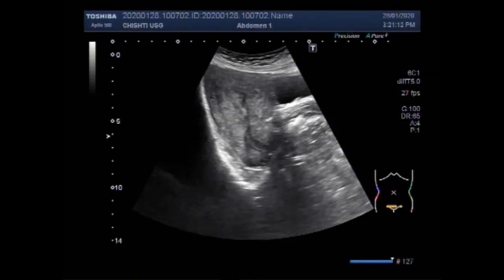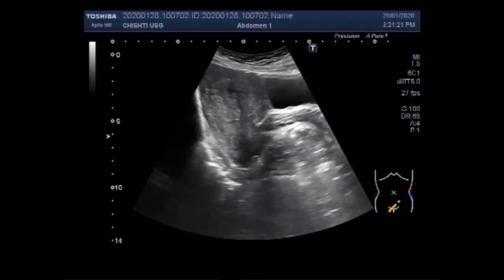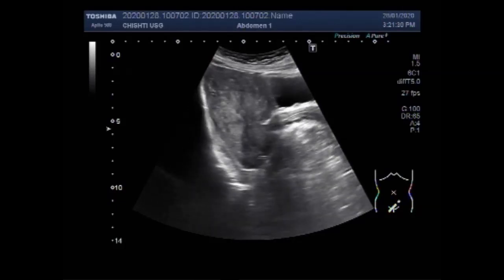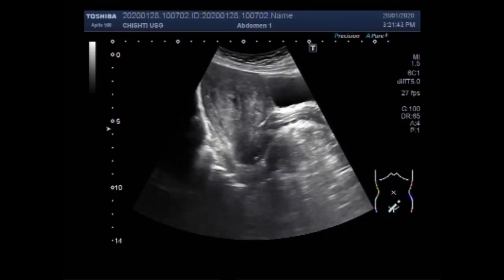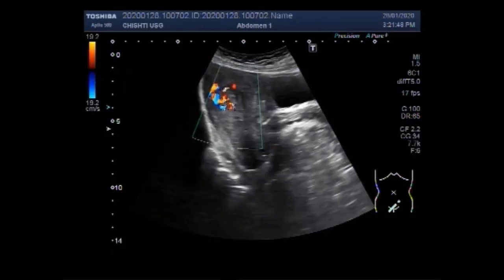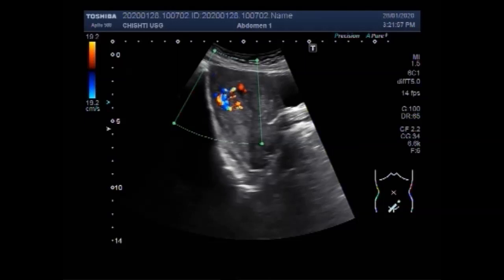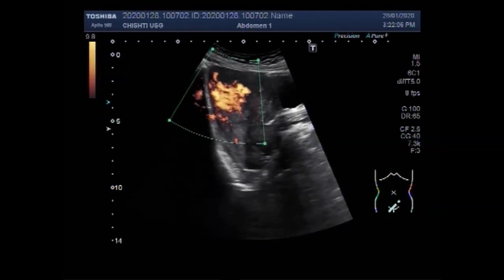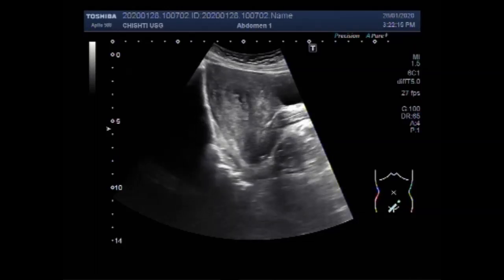This ultrasound video shows multiple cases — about three cases — of fibroid uterus. You can see the uterus, urinary bladder, and cervix. There is a fibroid in the central portion of the uterine cavity. A significant blood flow is seen in the fibroid, and this is a semi-solid to solid mass with a small amount of fluid in its interior. The mass is round to oval in shape.